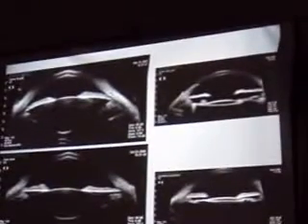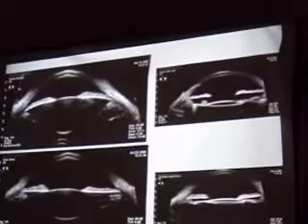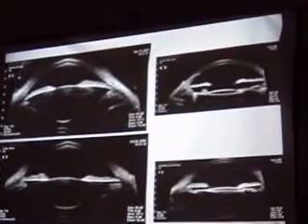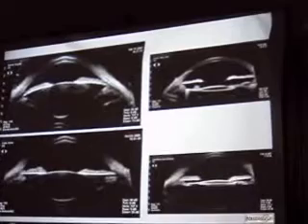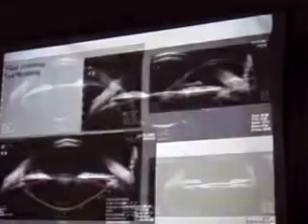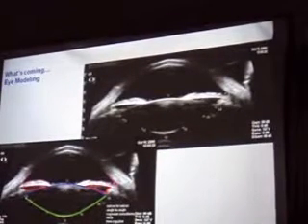The refractive optical diopter incidence of this position is hopefully going to be determined, and probably advanced into something that is not yet proved. There are 2 studies already started on that, about a pre-operative image, given shape of the eye, and how the lens is going to behave after implanting. This is why we're working on software called eye modeling.